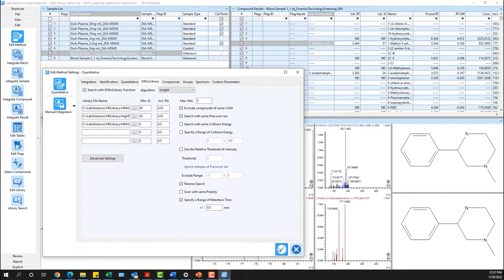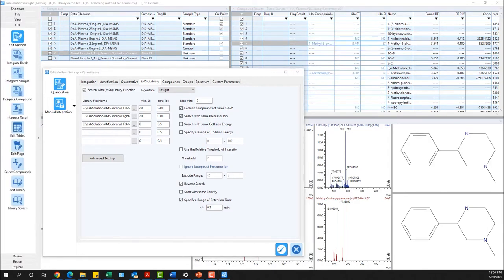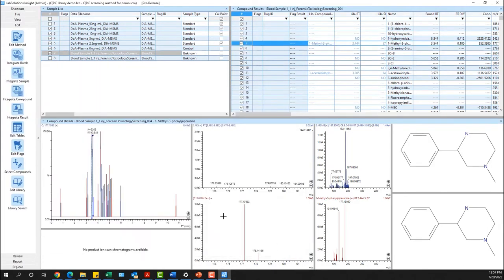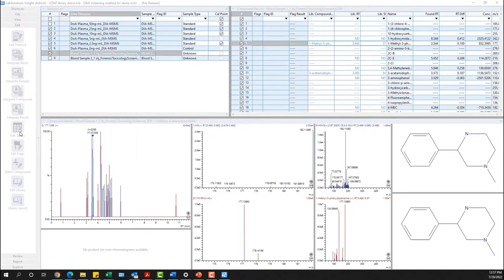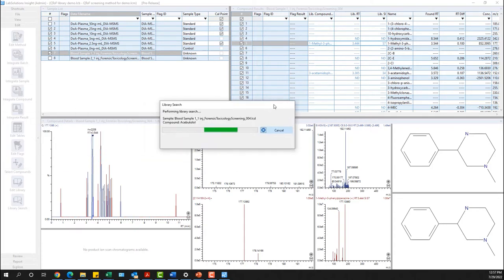Shimadzu offers a series of high resolution libraries that are suitable for both targeted and untargeted screening of commonly abused drugs, which include psychotropic drugs, pharmaceuticals, and even pesticides.